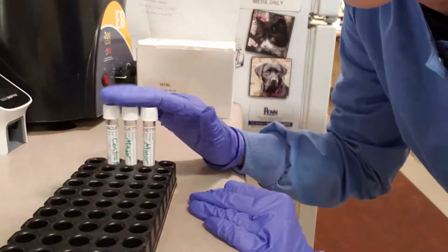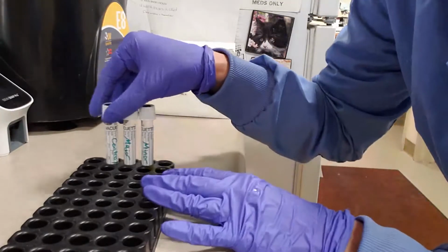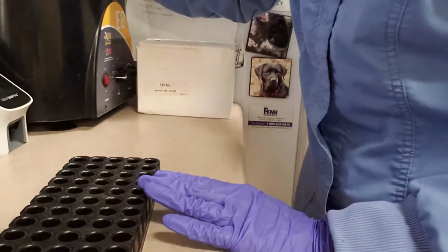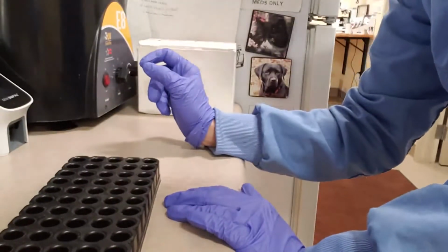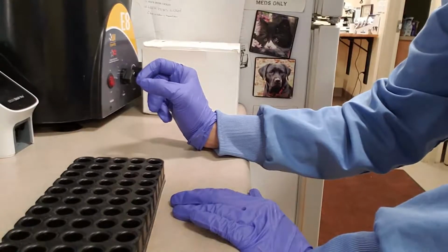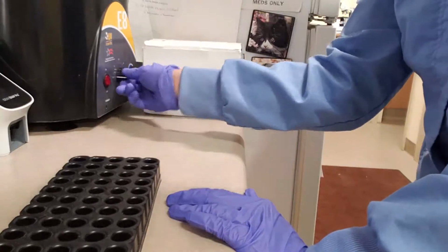Okay, so now that we've had our samples sitting for 15 minutes, we're going to centrifuge them for 15 seconds, and then we're going to examine them for macroscopic agglutination. So we've got our control, our major, our minor, and then to balance it out, we'll add another tube. All right, once it starts spinning, here we go. 1, 2, 3, 4, 5, 6, 7, 8, 9, 10, 11, 12, 13, 14, 15. So 15 seconds.